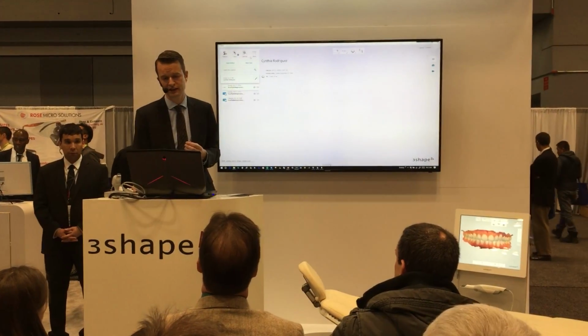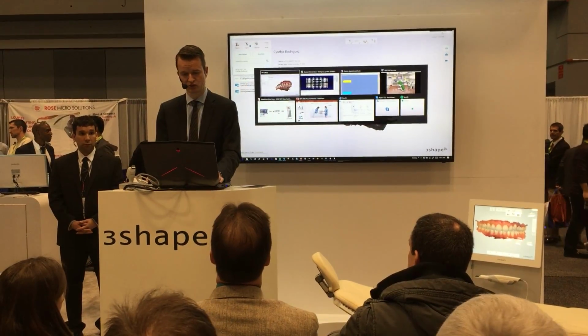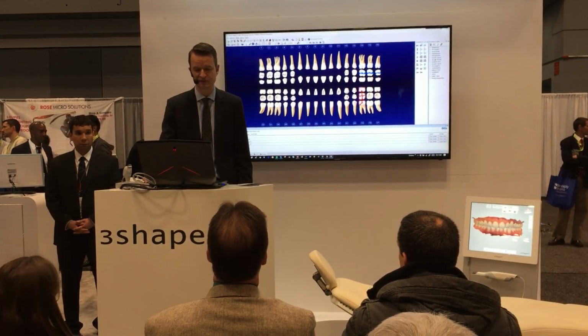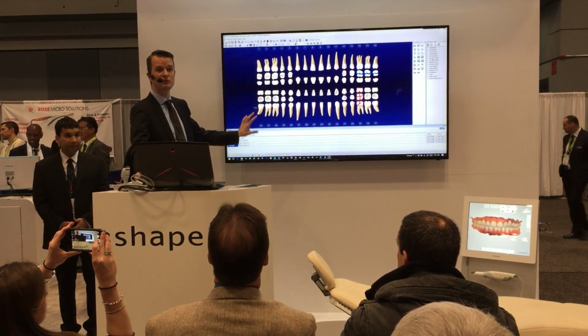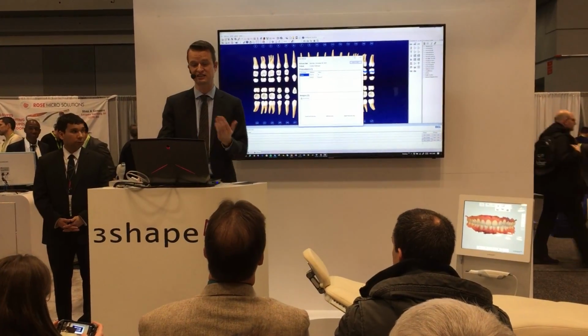So, and we are done now here. So it has been sent off. And if we go back to Dentrix here, you'll basically see now that we have the case. So the case is entered back into this panel developed by the DDX team. So it's basically coming back into the panel here. I can look at the case details.